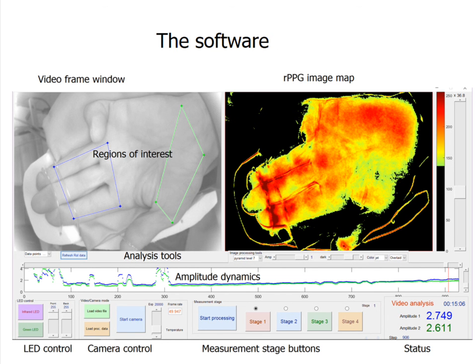Here is a screenshot of the rPPG imaging software, designed in MATLAB environment. The graphical user interface consists of several parts: a current video frame window, an rPPG image map, and a signal window displaying mean averaged rPPG amplitudes from manually selected regions of interest. There is also LED control, video camera control, measurement stage buttons with the ability to set time markers in the rPPG signal, a window with current time and microcirculation amplitudes, as well as post-processing analysis tools.